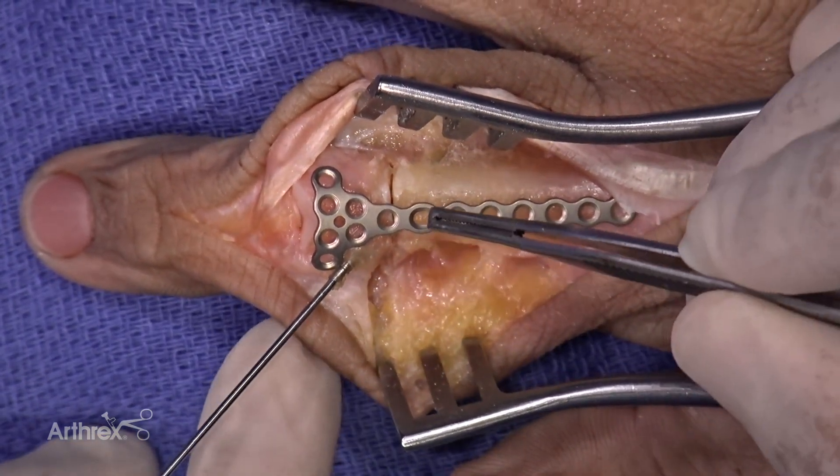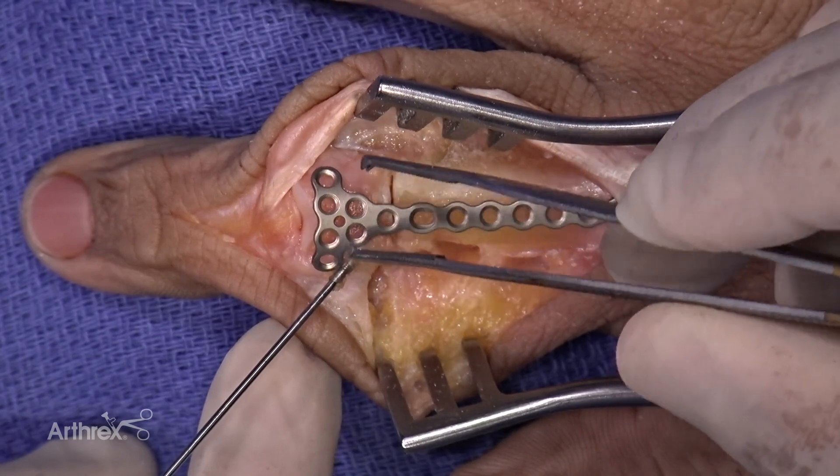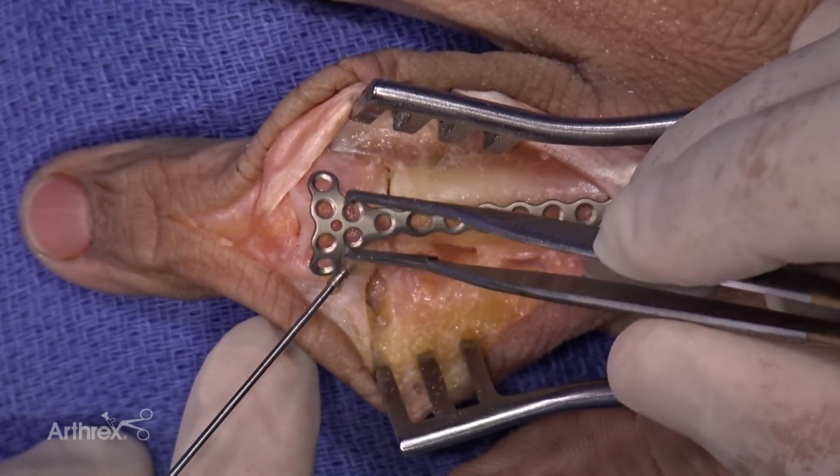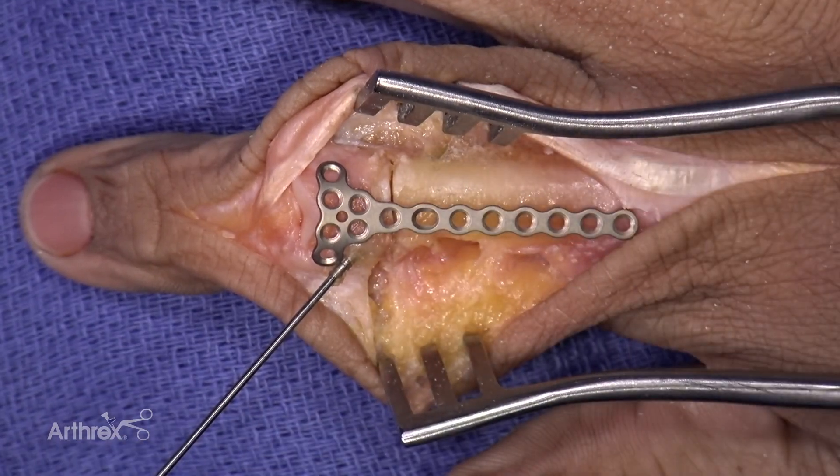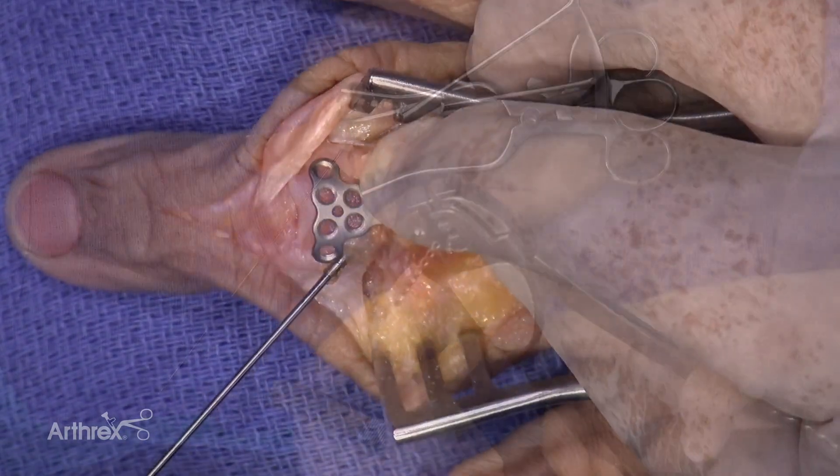The benefit of the triangular plate is that it conforms nicely to a lot of different surfaces in and around the joint, and gives you multiple different hole locations to put screws in, especially for more comminuted fractures.